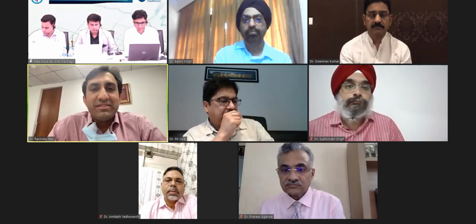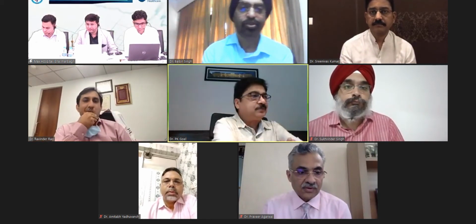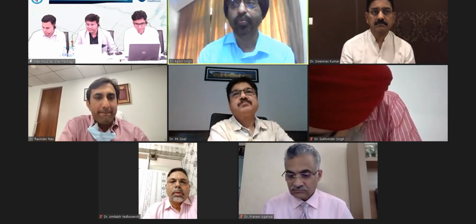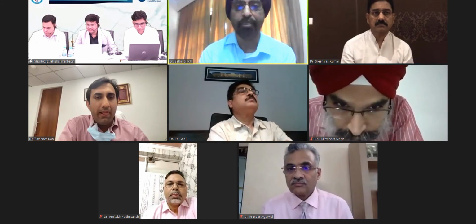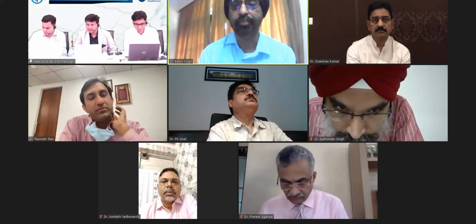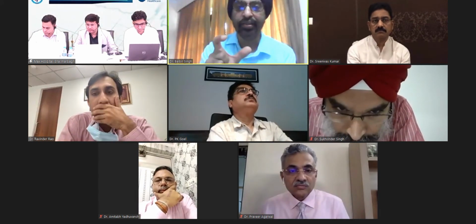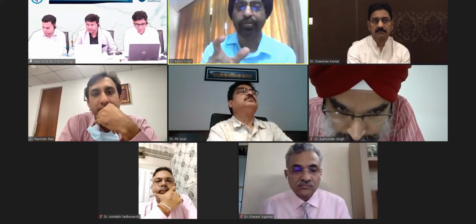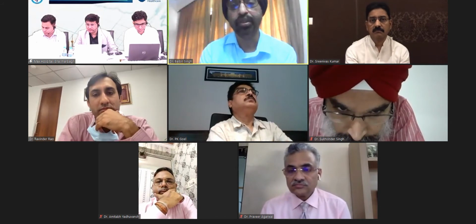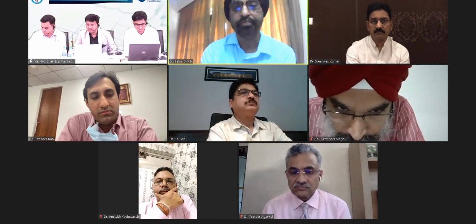So can I ask, what is flail gap and flail width? The last one. So this flail gap and flail leaflet. So gap is seen where they don't join. So that is the gap. The width is the leaflet. How much leaflet height is flail? So you calculate distance. So gap is the width, and the flail width is the length of the leaflet which is flail. How much leaflet? So if it is more than 8 millimeter flail, you will have a tough time getting hold of that.